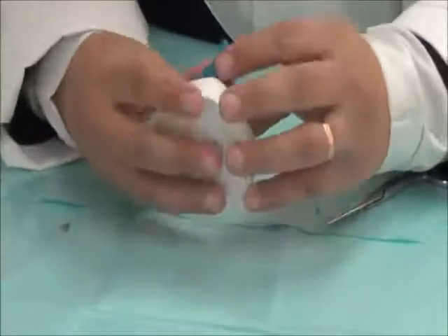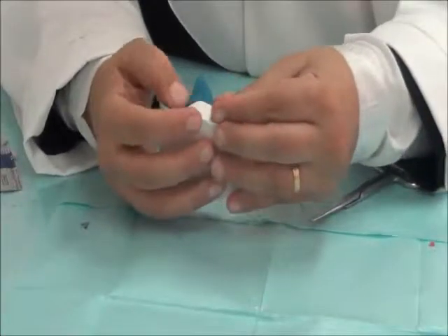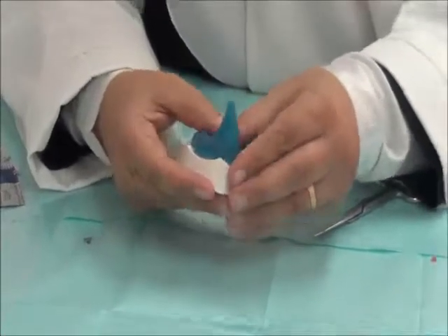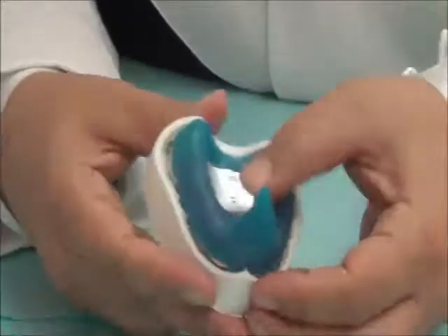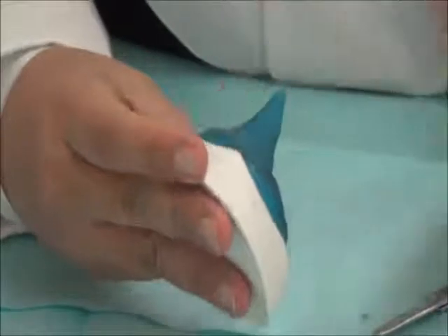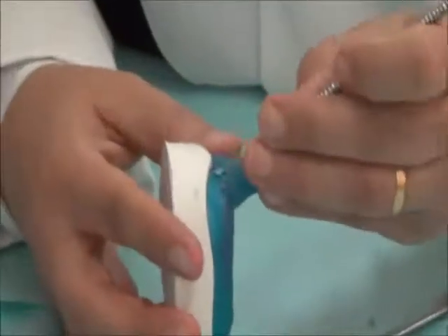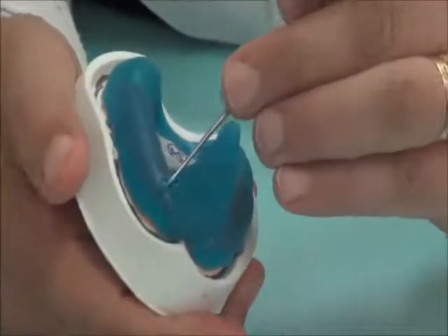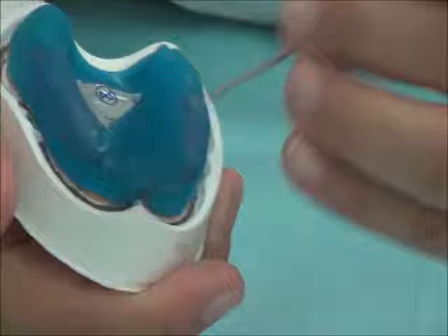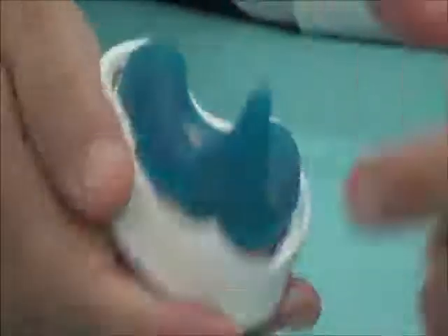Once we have adapted it like this, we keep pressing on the sides until the junction between the handle and the tray becomes smooth. We don't see any lines between the two materials. So this is the first step. We make sure that from all sides the parts are fused together.